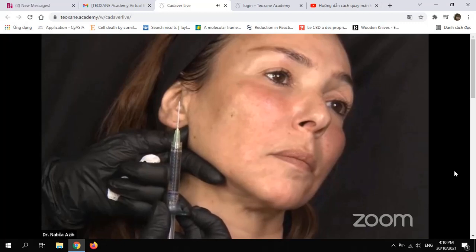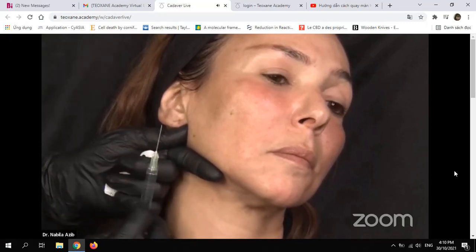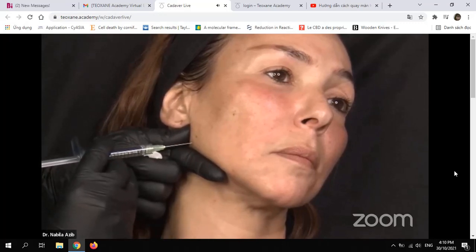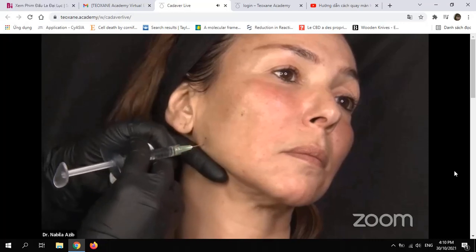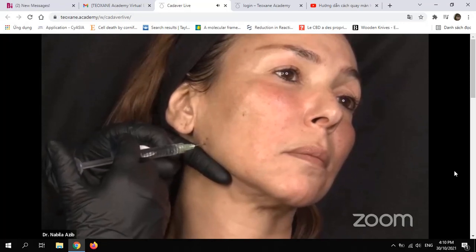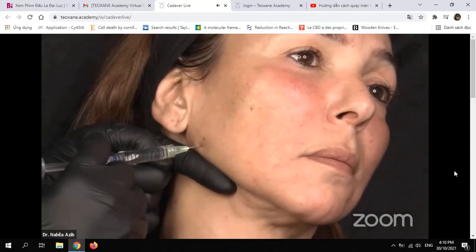in the bony structures. And for that, I'm using a 21 gauge needle for two reasons. First, it's a long needle. It will not be painful. It's a 21, it's a little bit, but here, as we have numbed the entry point, you see that I need also a long needle to reach the bone. You can stretch the skin here, yeah, and pinch it. The second reason is that it's already making for me the pre-hole for my 22 gauge cannula.